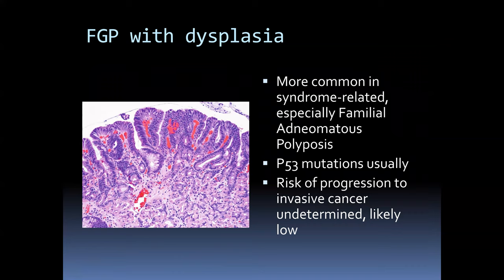Fundic gland polyps can present with dysplasia — a situation where you would not refrain from mentioning it. Here's a polyp with surface dysplasia, often associated with TP53 mutation, potentially in patients with familial adenomatous polyposis. What you don't see here is the glandular dilatation, which was further down in the polyp in the fundic-type glandular tissue.